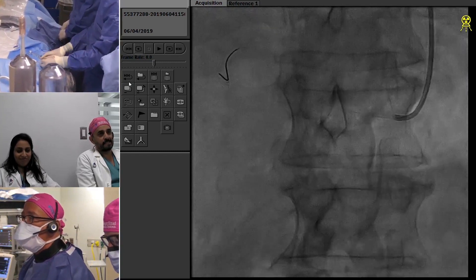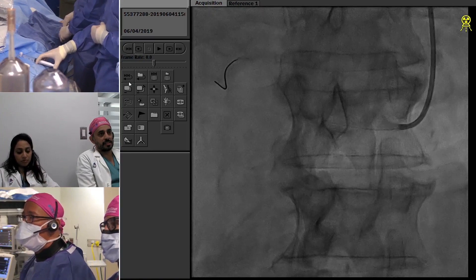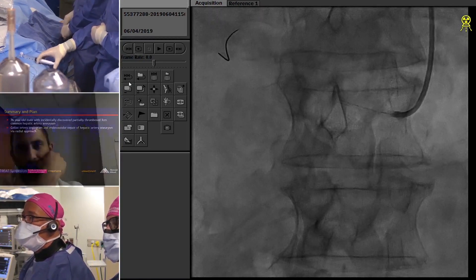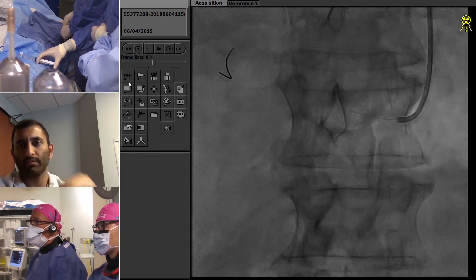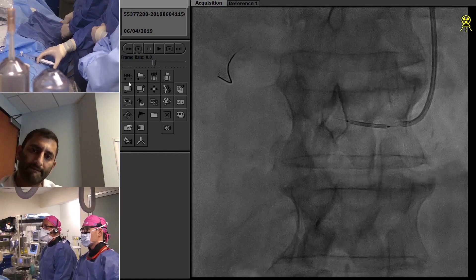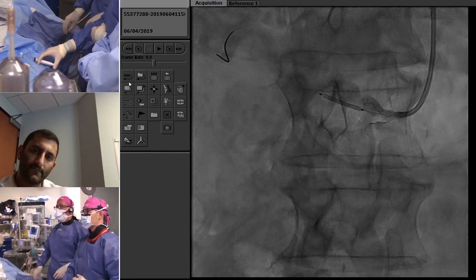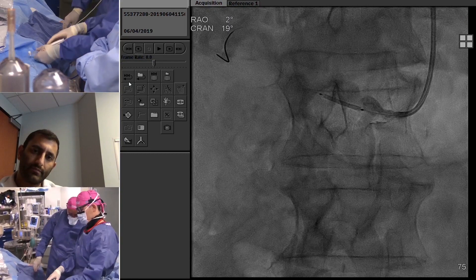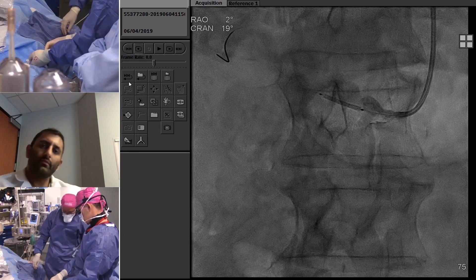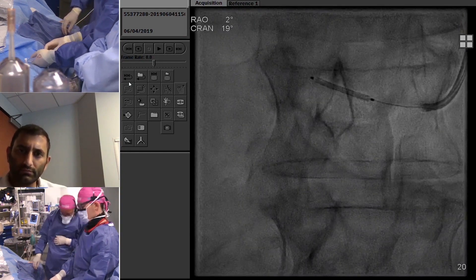The reason I have a support wire here is so we can deliver a stent readily. I'm now delivering a six-by-18 millimeter balloon expandable stent over the coronary wire, positioning it right across the neck of the aneurysm. We'll do an angiogram and get input from the room on whether we need one stent, two stents, or three stents.